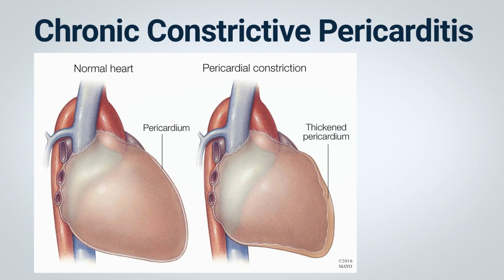Electrocardiogram patterns are not specifically diagnostic of chronic constrictive pericarditis. It is not uncommon to observe nonspecific ST-T wave changes and low voltage. The PR and ST segment findings may resemble those of acute pericarditis. Additionally, atrial arrhythmias, including atrial fibrillation, may occur.